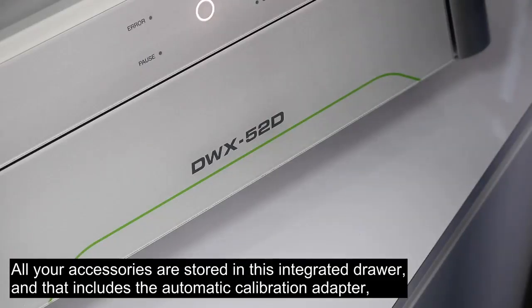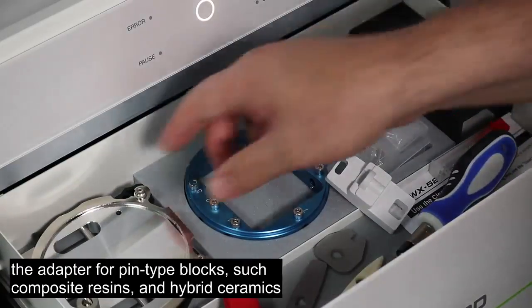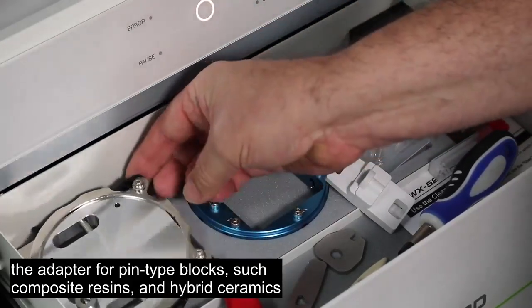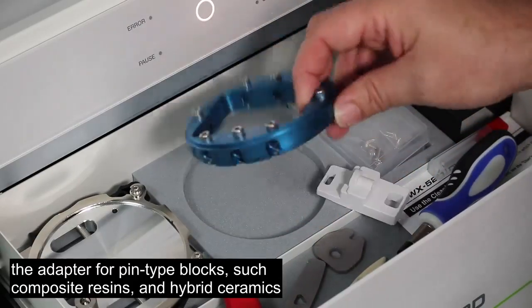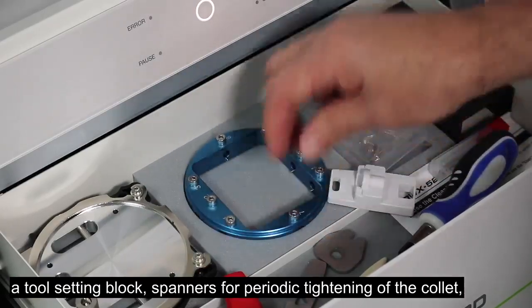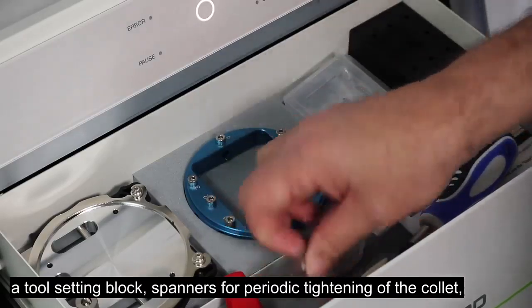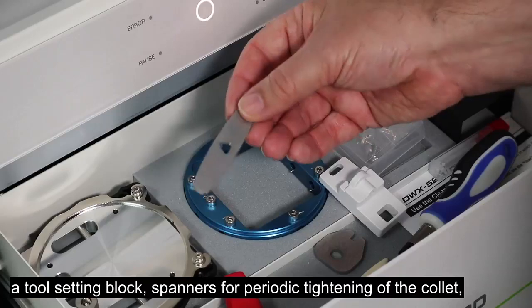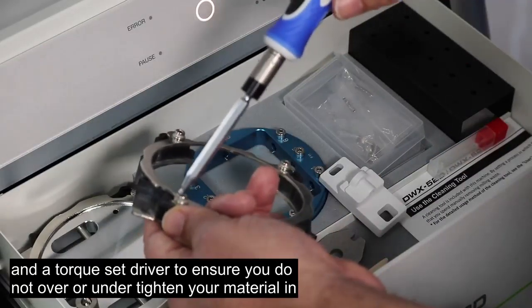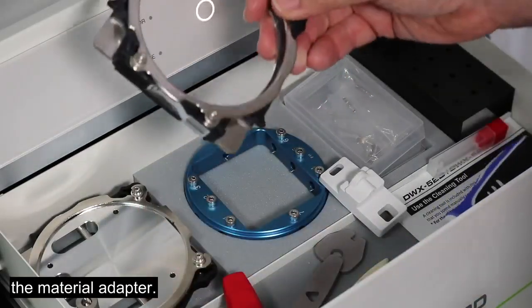All your accessories are stored in this integrated drawer, and that includes the automatic calibration adapter, the adapter to hold pin-type blocks such as composite resins and hybrid ceramics, the tool setting block, spanners for periodic tightening of the collet, and a torque set driver to ensure you do not over- or under-tighten your material in the material adapter.